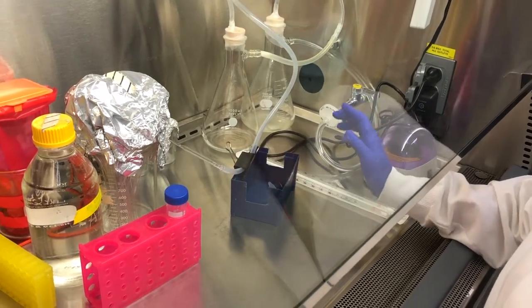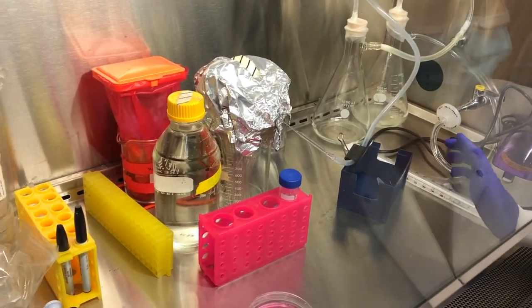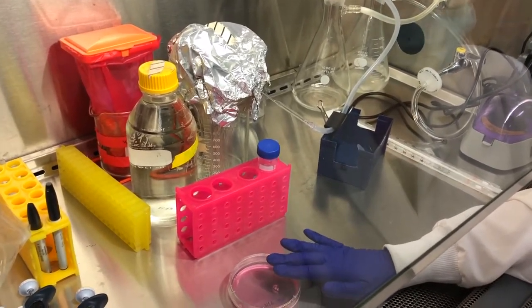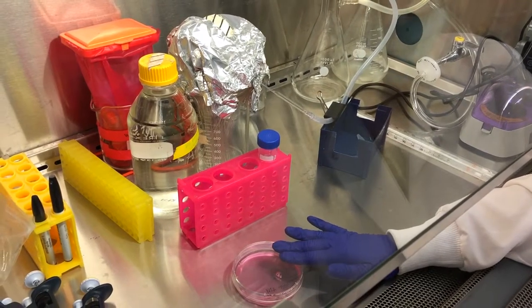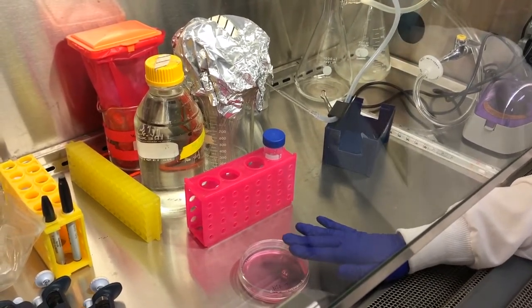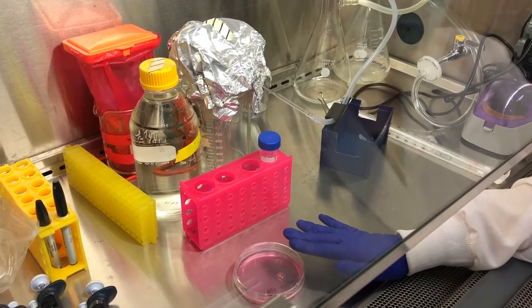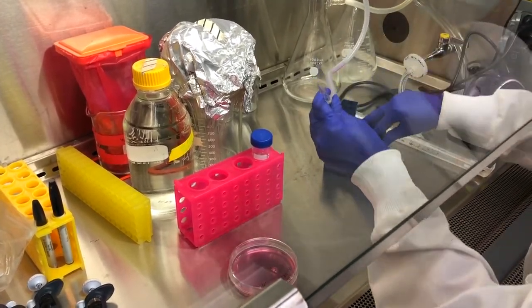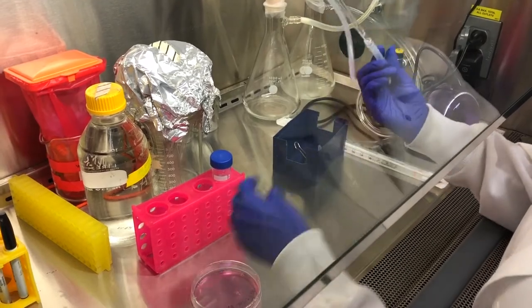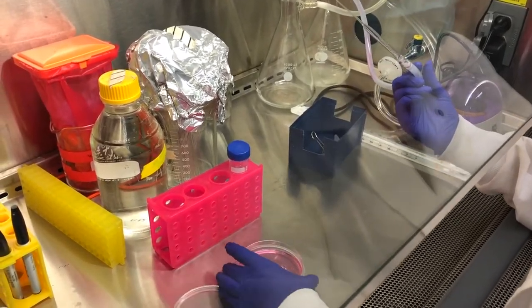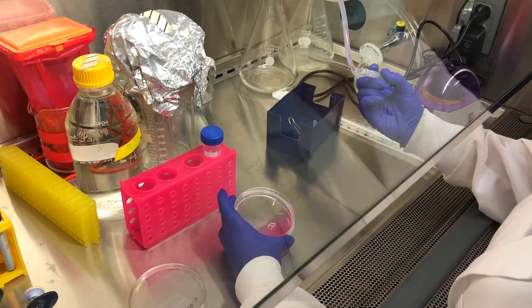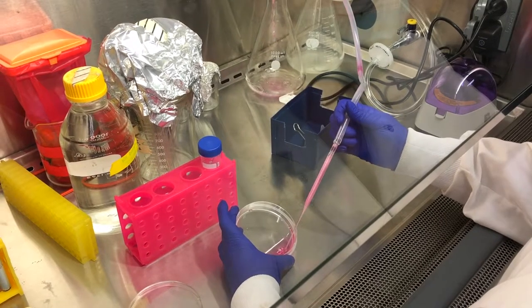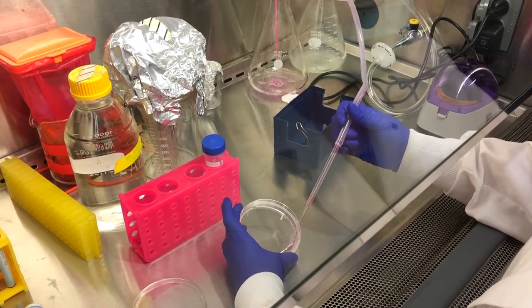So in order to first passage your cells, you're going to go ahead and aspirate the media from your original cell culture dish. And the cells are adhered to the bottom. So you won't be disturbing them when you aspirate the media. So I'm going to take this pipette and you just want to tilt the dish a little bit and get all of the media on one side.